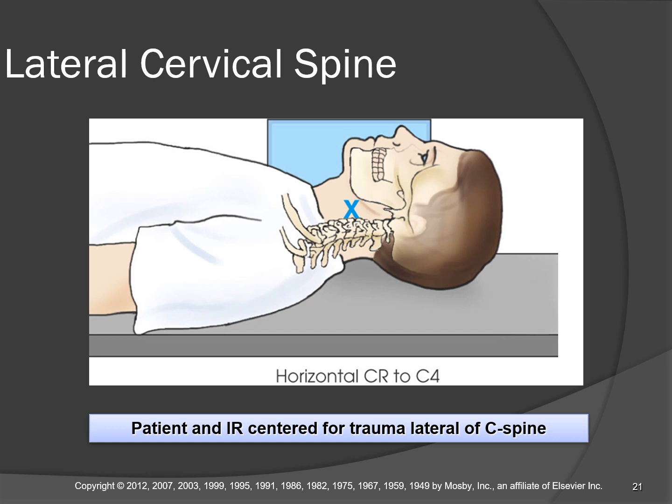If you don't pull traction on a recumbent cervical spine with cross-table lateral beam, you're only going to get down to about C5. If you're lucky, you're going to get C7, T1. But to even see C6 at half of C7, you have to pull traction on the shoulders when the patient's laying on their back.